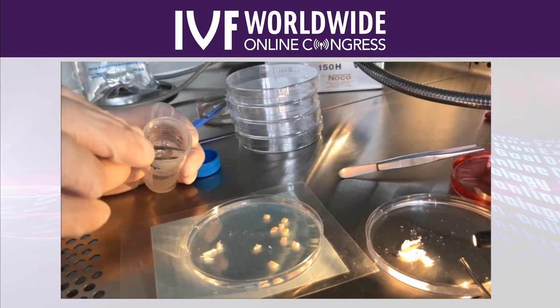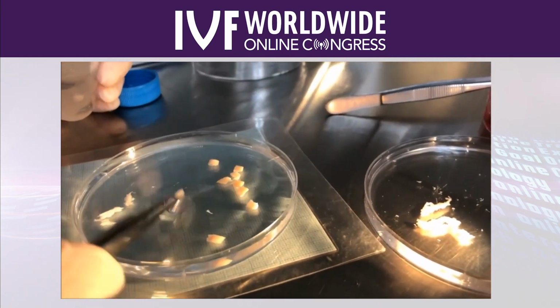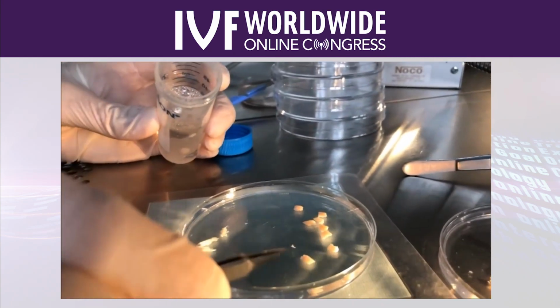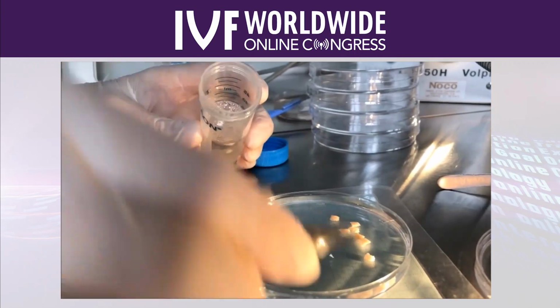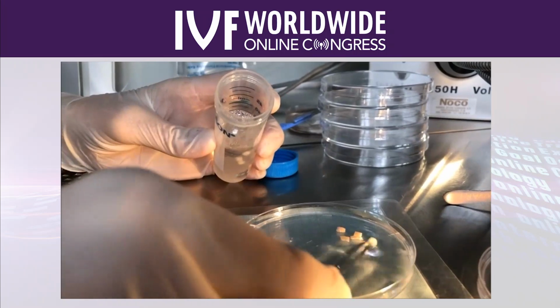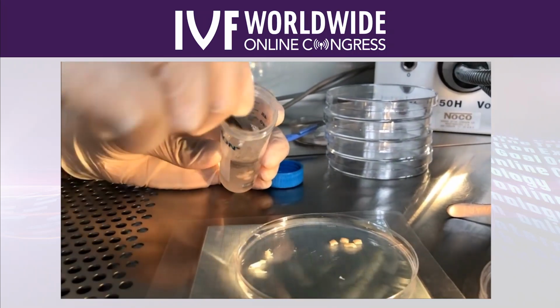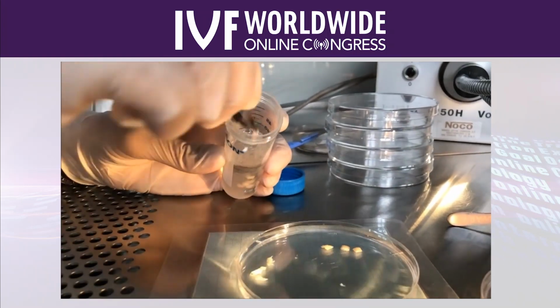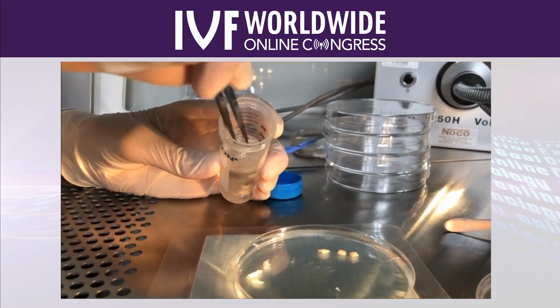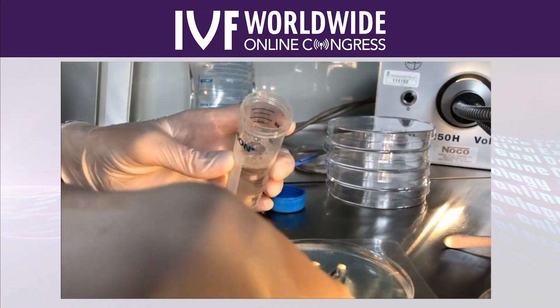So then we actually start the freezing, and we do this by putting the pieces of tissue into our freezing medium. This is where we, on our cryo journal, note the starting time, because when we start the freezing, this is kind of an equilibration step, but also a step where we wash away the surplus media.